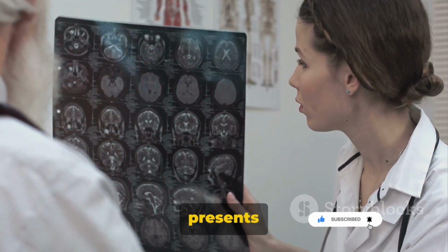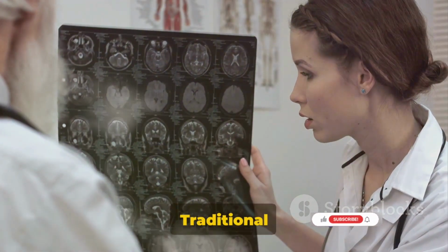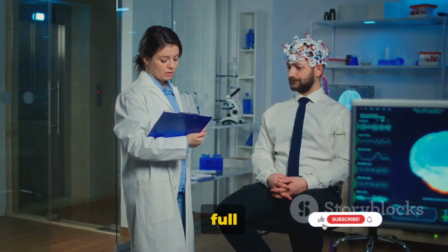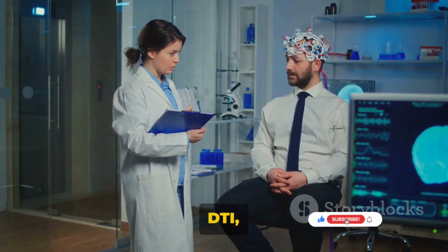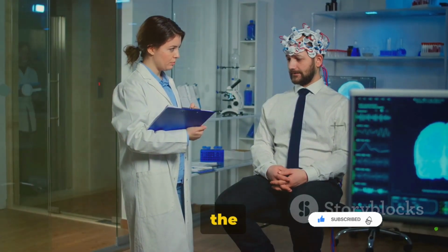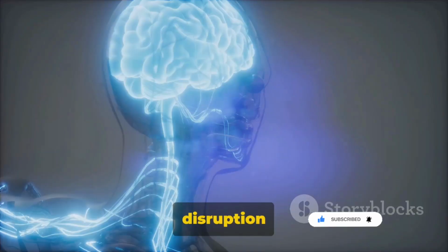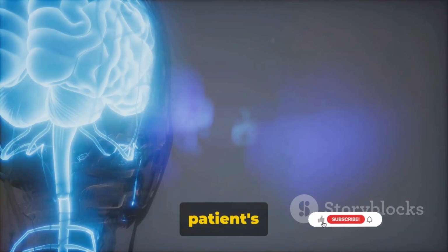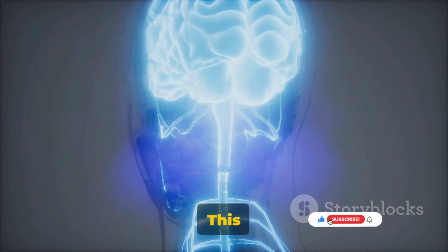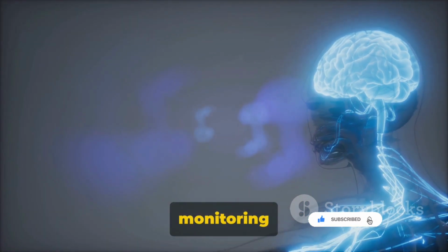A patient presents with motor deficits following a traumatic brain injury. Traditional imaging techniques may not reveal the full impact of the injury on the brain's structure. However, with DTI, we can assess the integrity of the white matter tracts. In this case, DTI showed disruption of tracts in regions associated with motor function, correlating with the patient's clinical symptoms. This information is invaluable in guiding rehabilitation efforts and monitoring recovery.